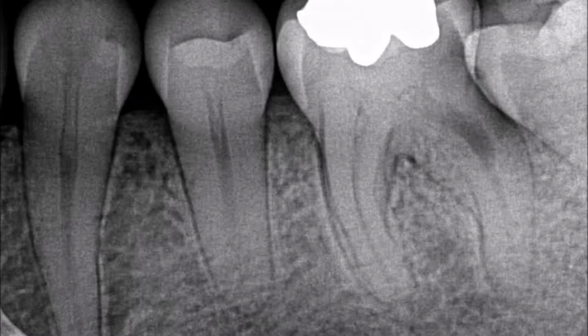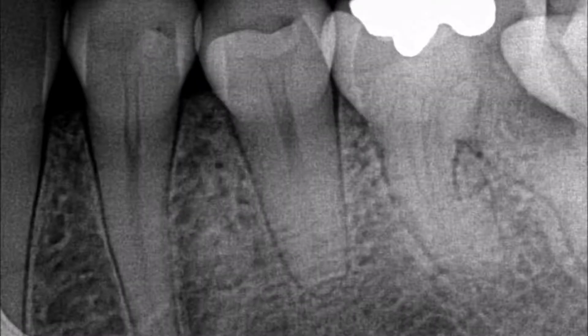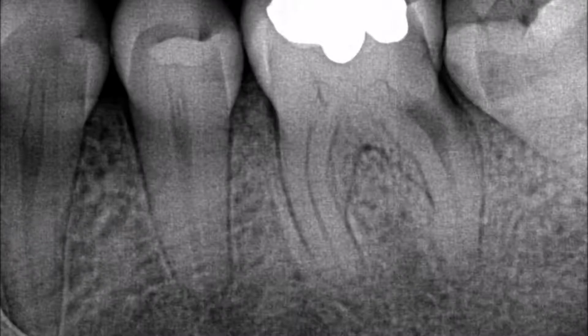The case that I'm presenting today was done, it's one of my last cases that I've completed in South Africa, and it is a case of internal resorption. It's my first case, and I haven't seen a lot of these. Usually we only see external resorption. As you can see from the angled photograph, we almost missed that, but the lesion, it's there and it's still centralized in the root.